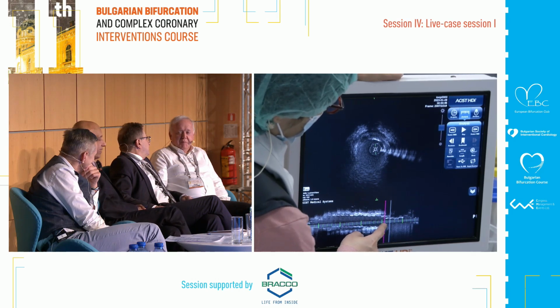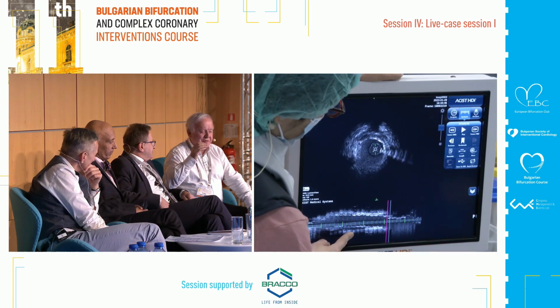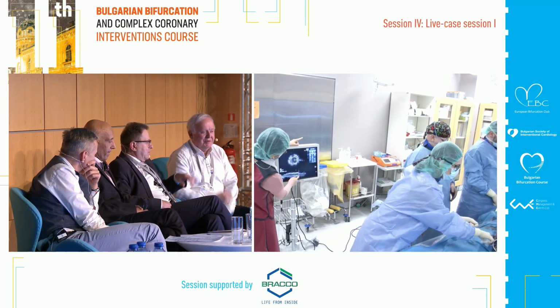Yeah, it's like a stent. But not proximally. It has been shown, just a little. I remember a paper showing that you have some elution of the drug from the stent distally, with the distal flow. Well, with the strut, but blood does not flow proximally.